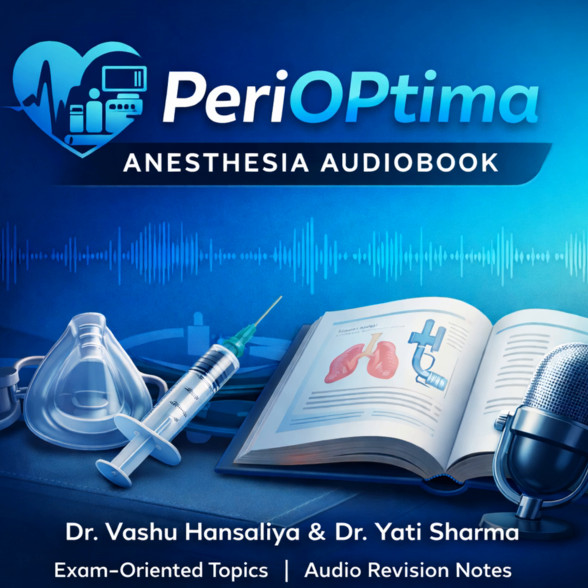And you should also be ready to talk about other artifacts that make it even worse. Decreased perfusion, dark skin color, which makes it less accurate at low sats, and abnormal hemoglobins like carboxyhemoglobin. Right. Okay, let's pivot now to the systems that manage the patient's internal environment. Humidification and heat exchangers. The goal here is managing heat and moisture loss. It's slower than a gas line failure, but just as profound.